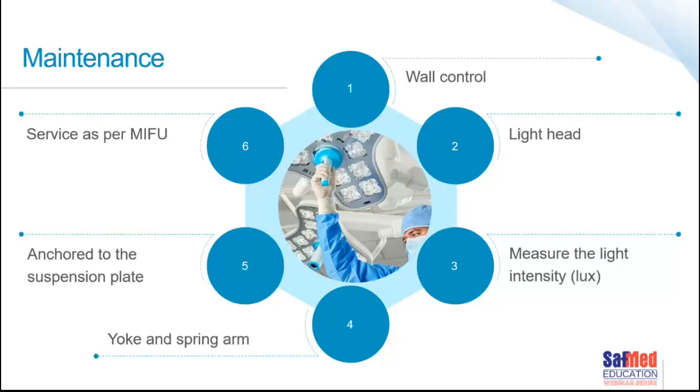The light head itself, managing it, looking after it. I mean, there's so many logical things about not bashing, not banging, being cautious with how you bring the light into the field. There's also the issue around surgical field contamination on the light head itself, so not banging the two lights together and making sure that the head is correct, both anatomically and working correctly.